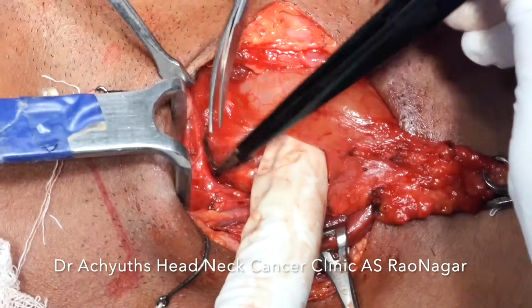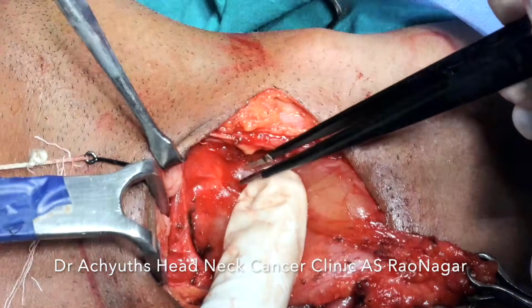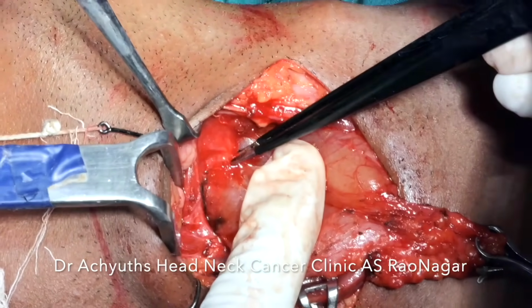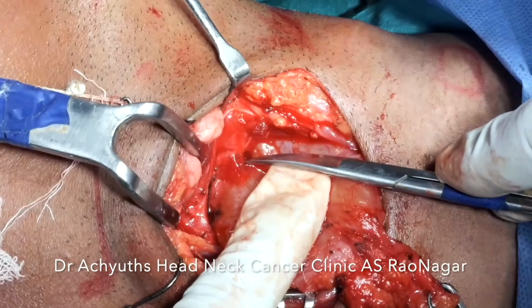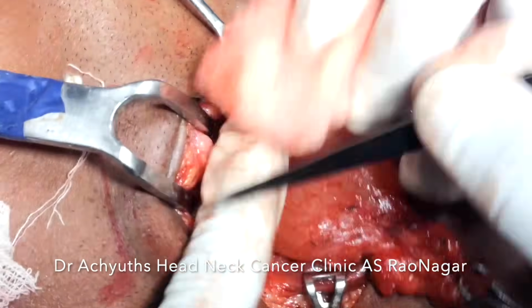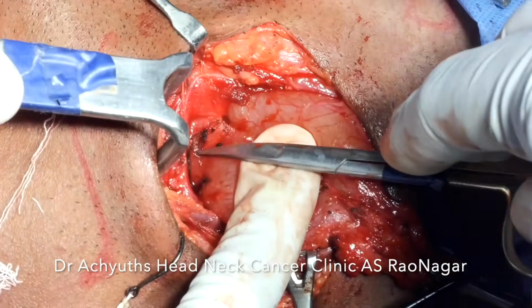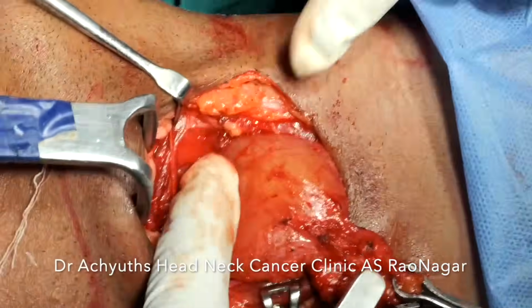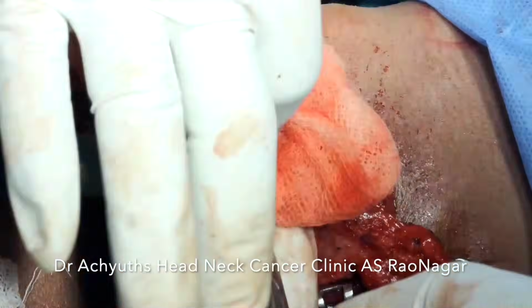Where we cannot insinuate the fingers because of the space constraints, we can use this tonsil elevator, or you can use Freer's elevator, whichever is more comfortable for us. But tonsil elevator, because of its more surface area, the damage to the cyst wall will be little less when compared to Freer's elevator. And when both are present, I will definitely want to use a tonsil elevator only.